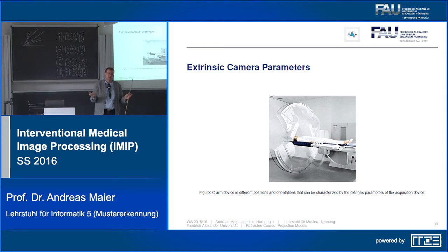Yeah, so the acceleration is of course different when you start rotating this, but you have machinery in there that is also sensing how fast it accelerates. But in general, the mechanical stability of this thing is truly a challenge. And the nice thing is that C-arm systems are fairly reproducible. So when you do the same motion with the same kind of acceleration, you will get the same motion, and therewith at every camera position you will get the same projection matrix. The intrinsic parameters like F, which we will talk about shortly, will slightly change but not too much, and we will calibrate extrinsic and intrinsic parameters in one go anyway.